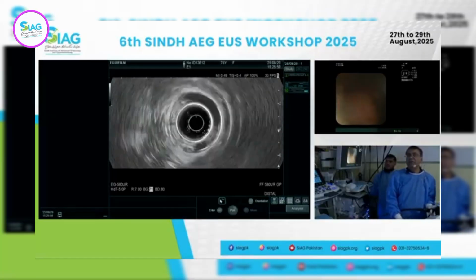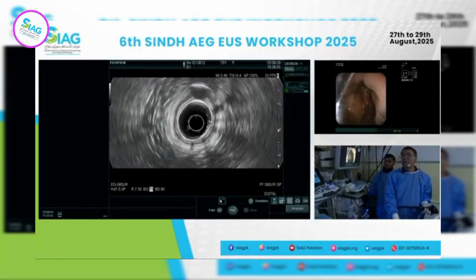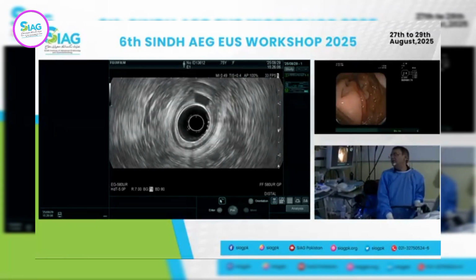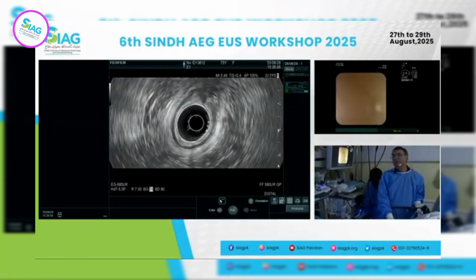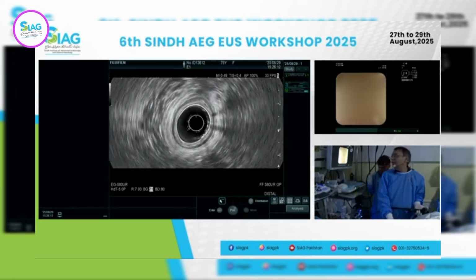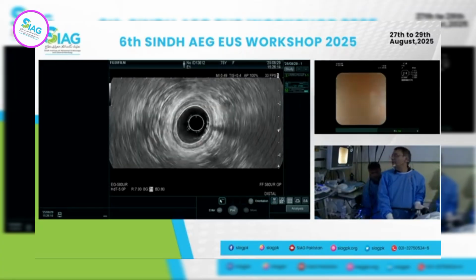Let me see if I can demonstrate one more time. Right here. Increase the section a little bit. Okay, regular section. Okay, good.